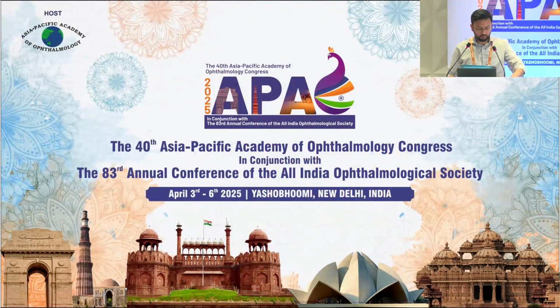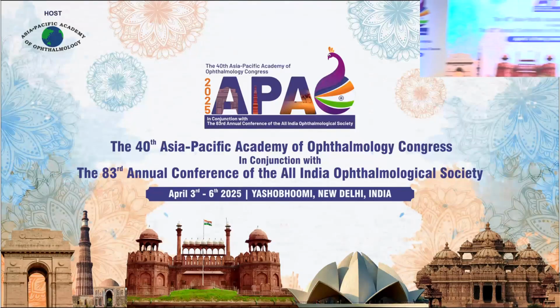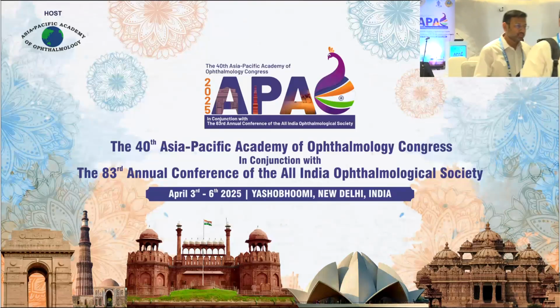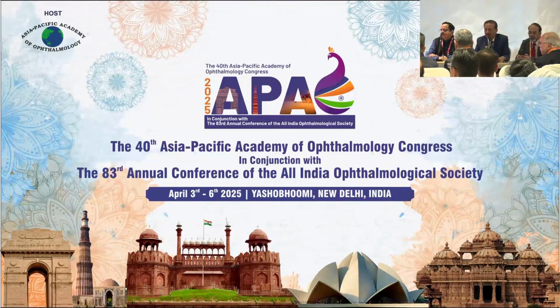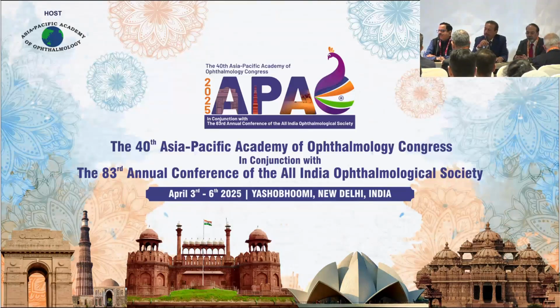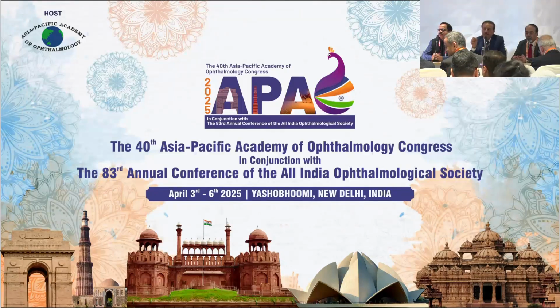And this is the gamut of different videos which we have shown, different situations you can come across in your clinical practice. Posterior capsular rent is one of the very serious complications which we can come across during our cataract surgery, phaco surgery. How you manage the posterior capsular rent is very important, because it's not that we do not get the posterior capsular rent, we all get it. But how you manage it is very important, because you can give a 100% result to the patient even after the posterior capsular rent.